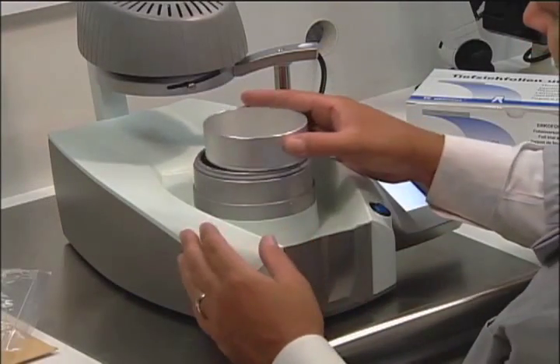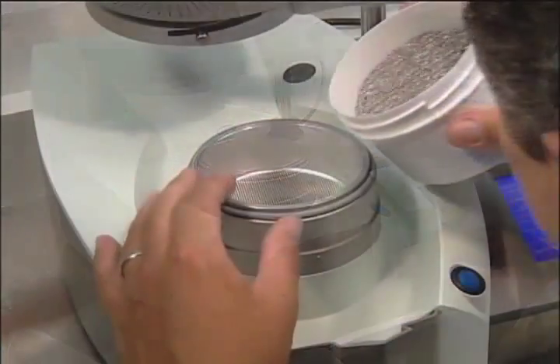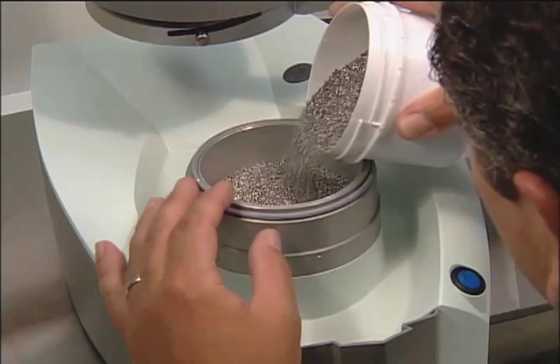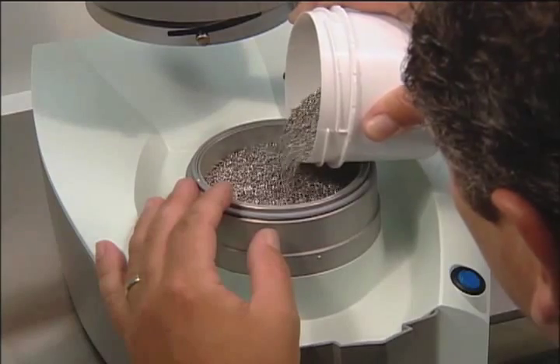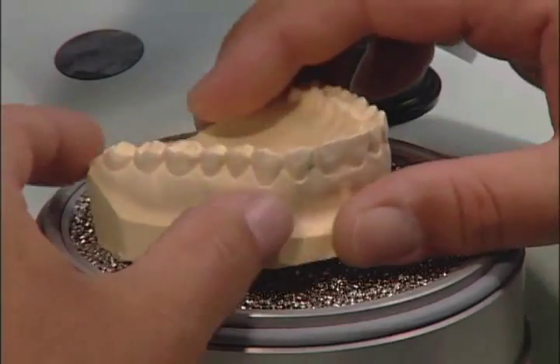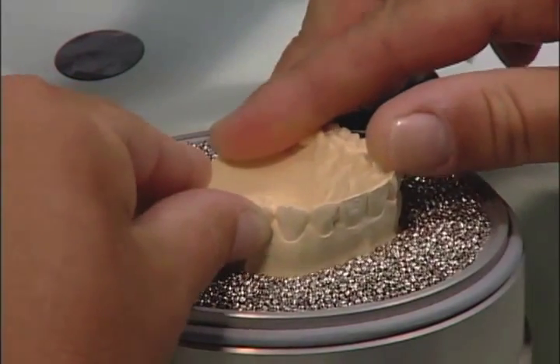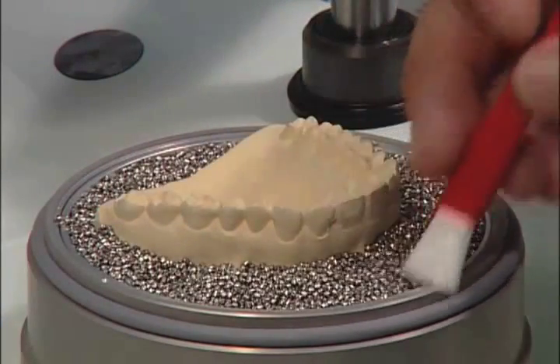Place the form pot into the forming chamber. Fill the form pot with steel granules. Place the stone model into the granules, only exposing the area to thermoform. Use your brush to compress the granules.